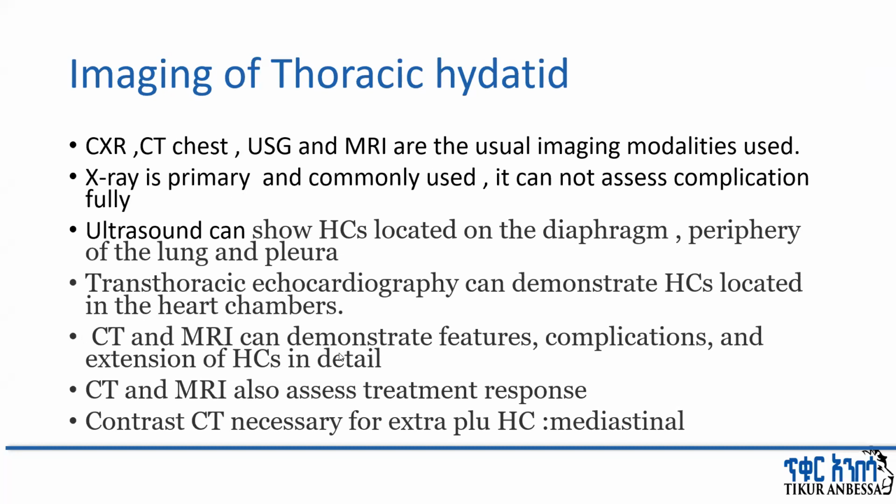CT and MRI can demonstrate features, complications, and extension of hydatid cysts in detail. CT and MRI also assess treatment response. Chest X-ray note: contrast CT is necessary for extrapulmonary hydatid cysts, like mediastinal ones. If the cyst is located around the great vessels, you should use contrast CT.